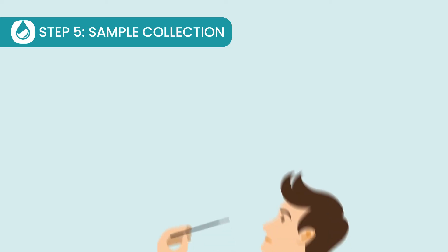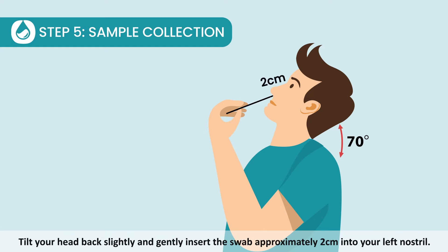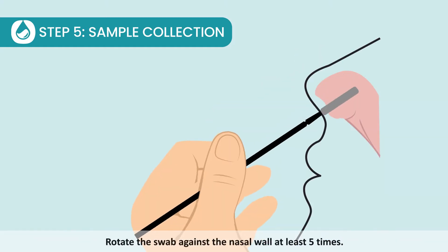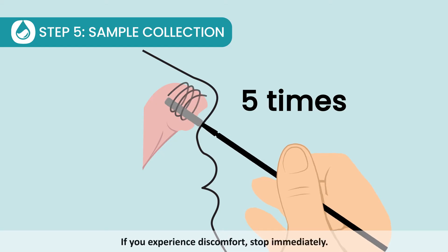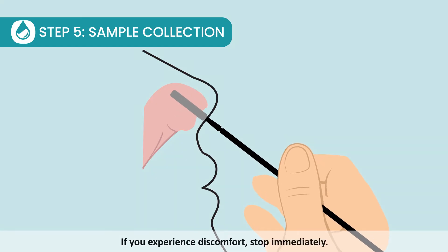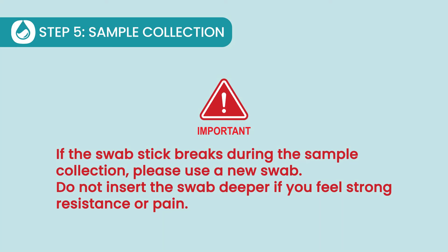Step 5: Sample collection. Tilt your head back slightly and gently insert the swab approximately 2 cm into your left nostril. Rotate the swab against the nasal wall at least 5 times. Repeat the same process for the right nostril. If you experience discomfort, stop immediately.